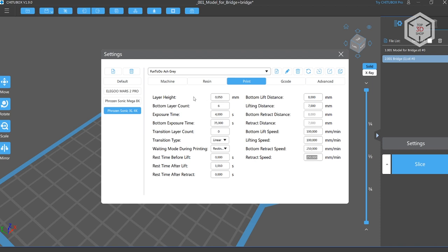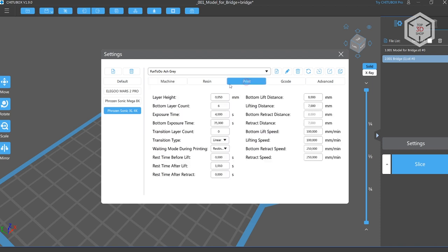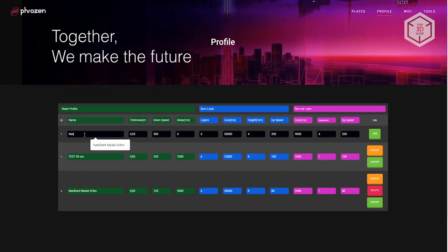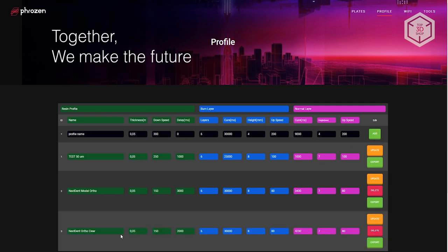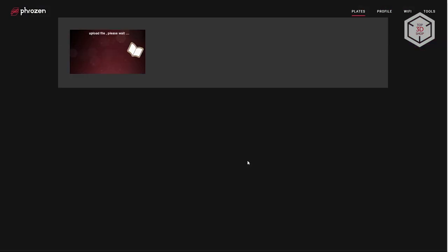The most important thing is that the printer settings in the slicer should be configured correctly, with the layer height matching that of the resin profile in the web interface. Log on to the printer's page through the browser, open the Print Profile tab, and configure the settings. The list is quite standard, except that you need to take into account that all the time is set in milliseconds. On slicing the model, the prepared file is loaded into the printer through the Plates tab.